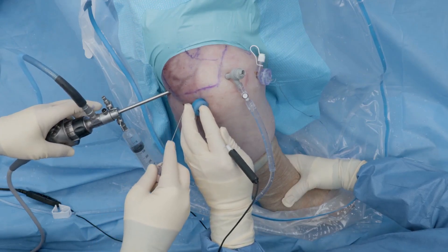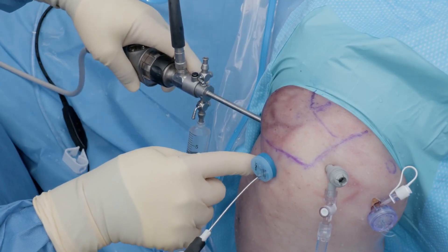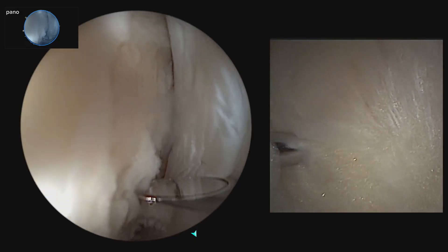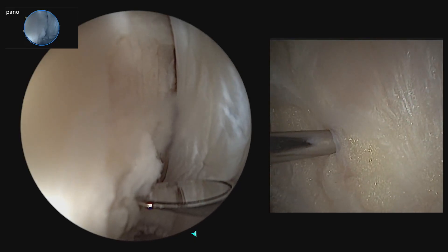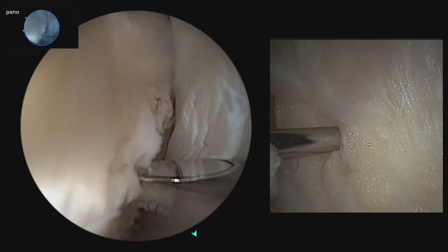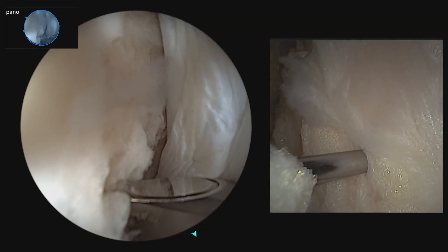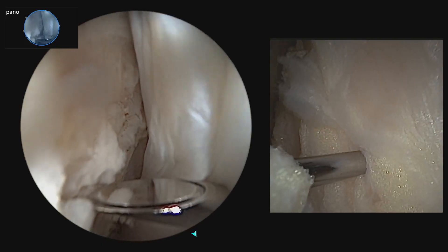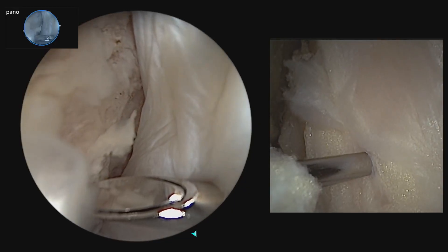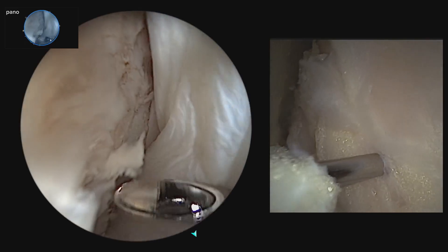We insert a percutaneous spinal needle just inferior lateral posterior to our lateral working portal. The goal is to use the percutaneous needle to get through the musculotendinous junction of the infraspinatus while the shoulder is in internal rotation so we don't over-tighten the shoulder. By internally rotating the shoulder, the infraspinatus will lie flat in the Hill-Sachs lesion, limiting over-capture and preventing over-tightening and loss of range of motion postoperatively.